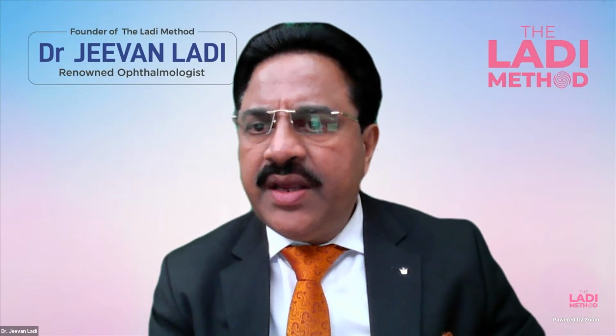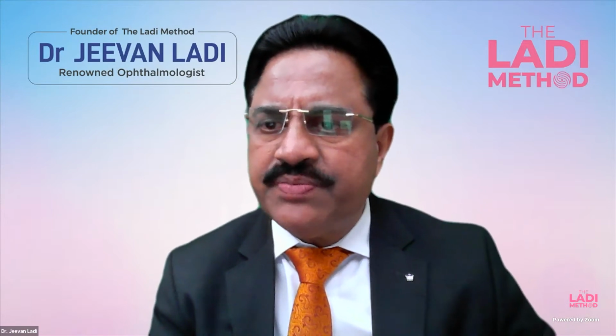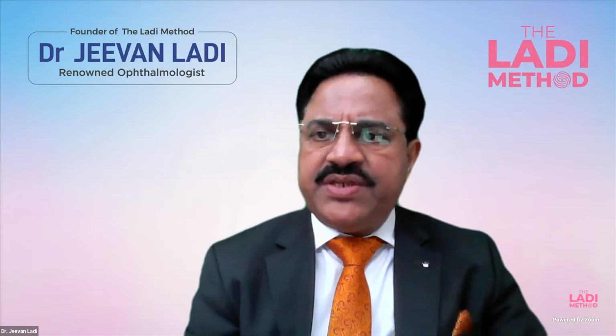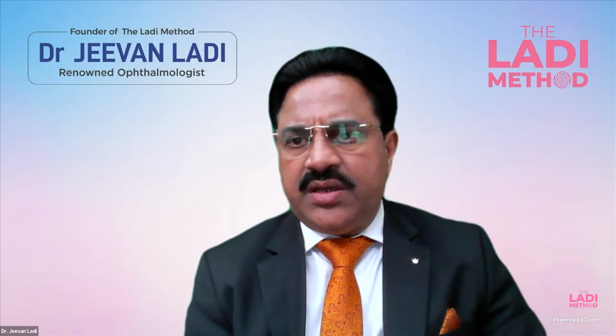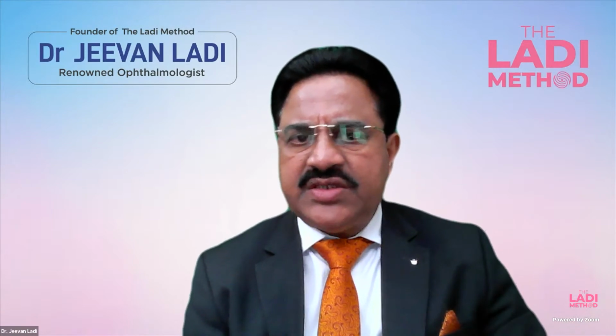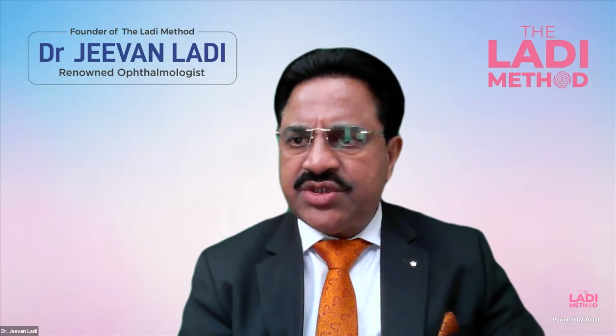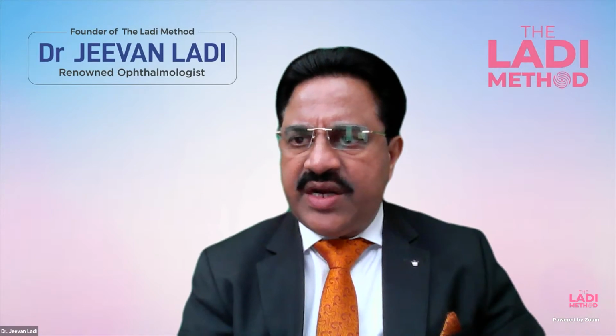Dr. Sachin Pagade from Maharashtra wanted to know more about calculation in case of premium IOLs. Premium IOLs are basically anything which is a monofocal lens with asphericity or a variety of multifocals. And yes, we can very confidently use either method, either immersion or optical biometry, and get your power as accurate as possible with amazing results.